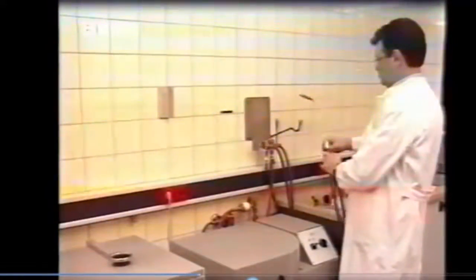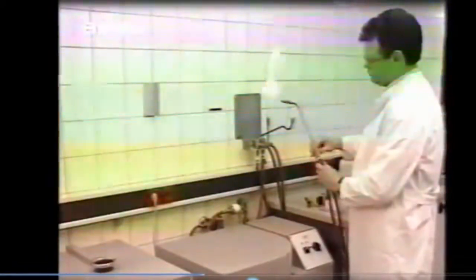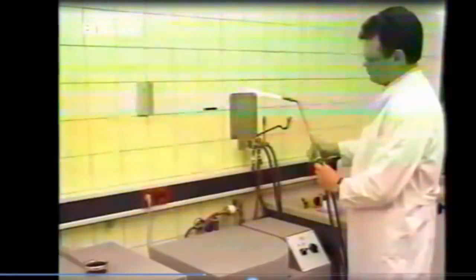In the case of wironium extra hard, centrifuging is started with the lowering of the crucible coil 2 seconds after the shadow disappears from the melt. The centrifuging time is set in the factory. Melting with a flame is an alternative. A mixture of acetylene and oxygen, propane and oxygen, or the natural gas and oxygen used here is suitable.